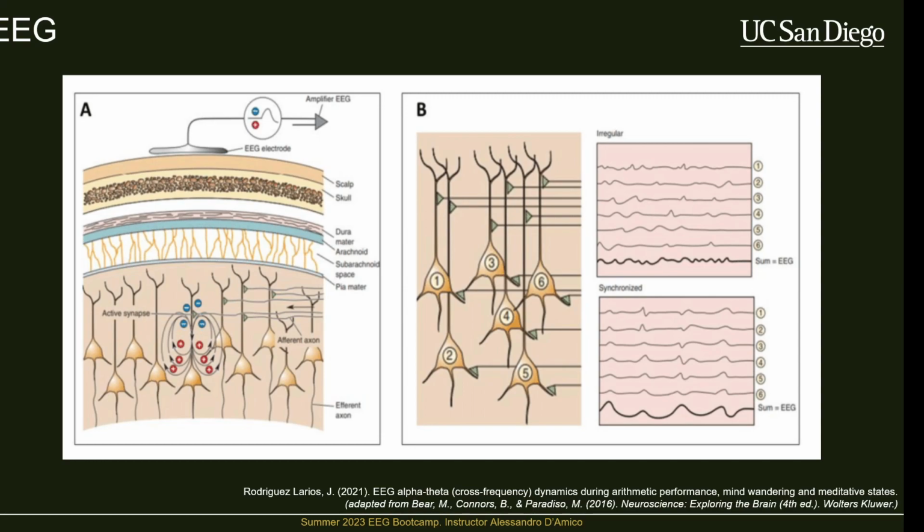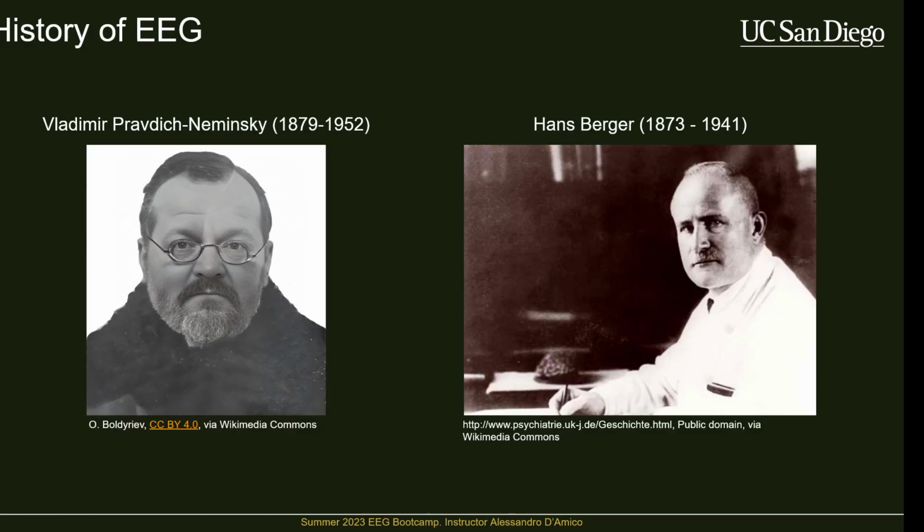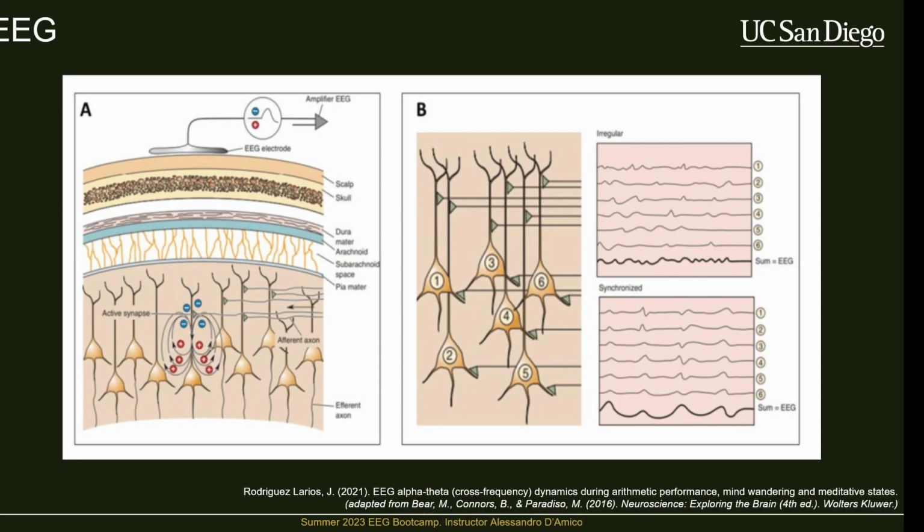So it's just difficult to give analogies for. Wait, so it's called a low pass filter because lower frequencies pass? Exactly. That's exactly the way to do it. And again, it sounds silly because it's so literally the case, but it's still always confusing when you're learning it for some reason. I don't know why, but it literally just lets the low signals pass through.